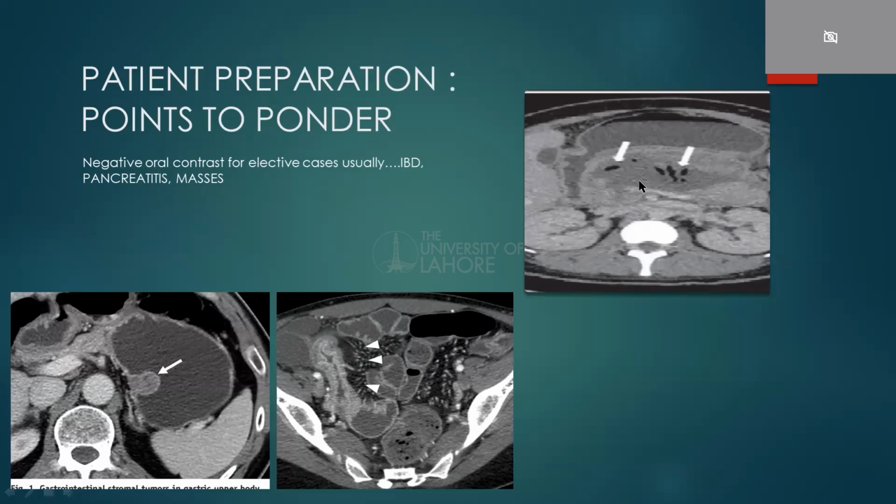Another patient with pancreatitis and pancreatic necrosis, and we see the plain fluid in the stomach, and we see the fluid collection in the pancreas, and the intervening plane between the two structures is very nicely elucidated in this slide. So just to emphasize the significance of a negative contrast medium, that is plain water, in elective cases.